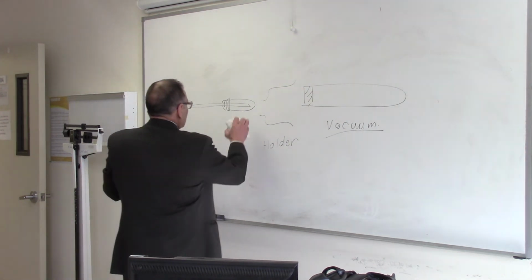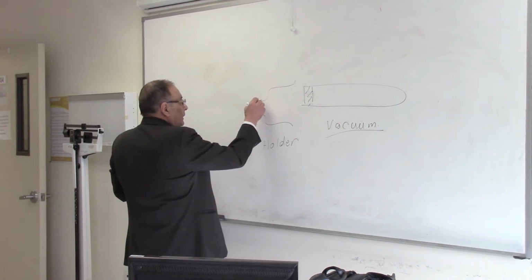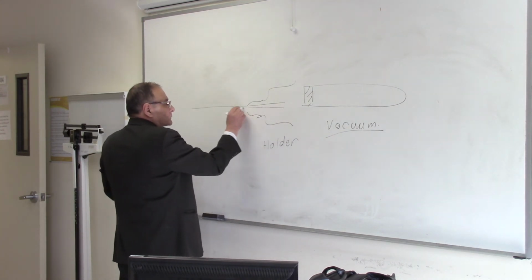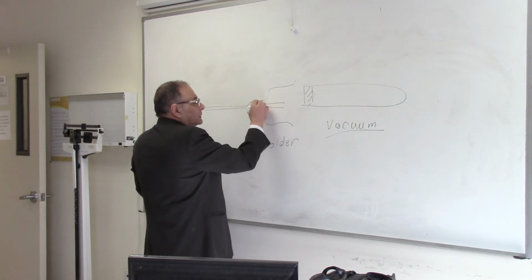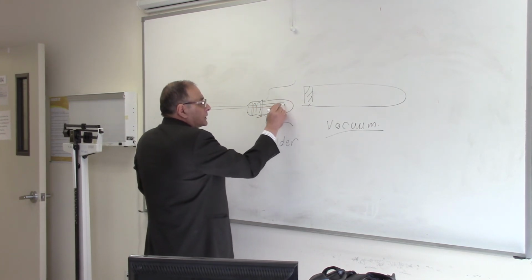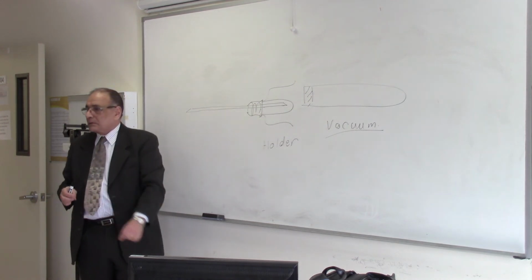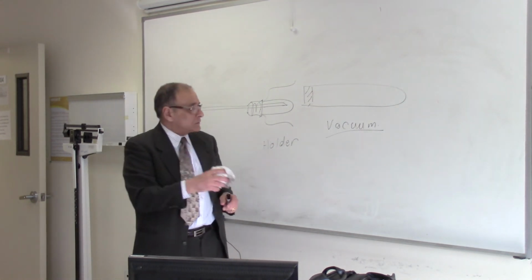When you put this tube and the needle in the holder, this is the hub, and that is the needle. The inside part is covered by a rubber sleeve. It's going to be this way here. I'll show you practically how to do it, and you will do it yourself.